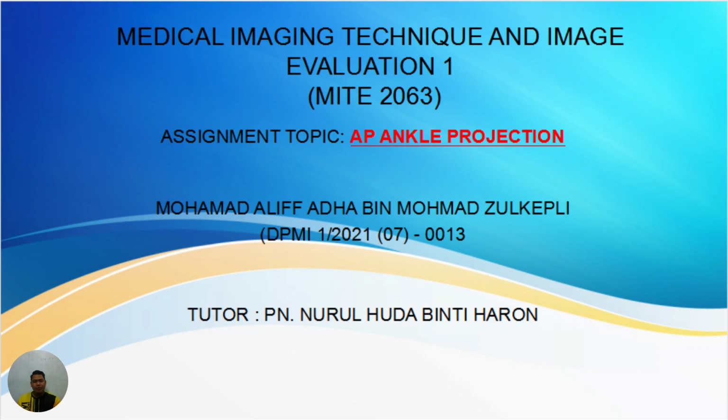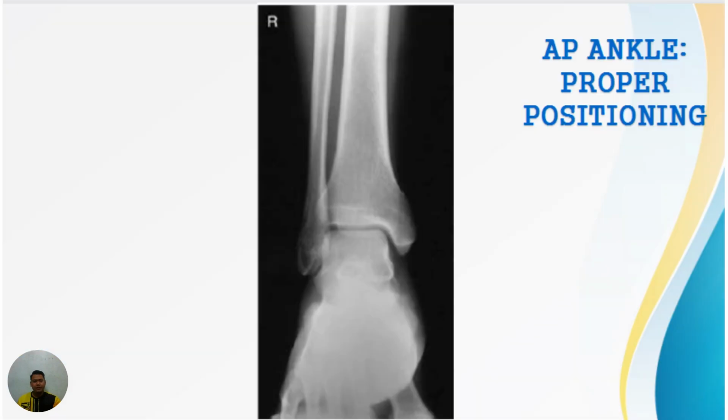My name is Muhammad Alif Adaha bin Muhammad Zulkifli, and today I am going to present about AP ankle projection. First and foremost, this image is a true AP ankle proper positioning.